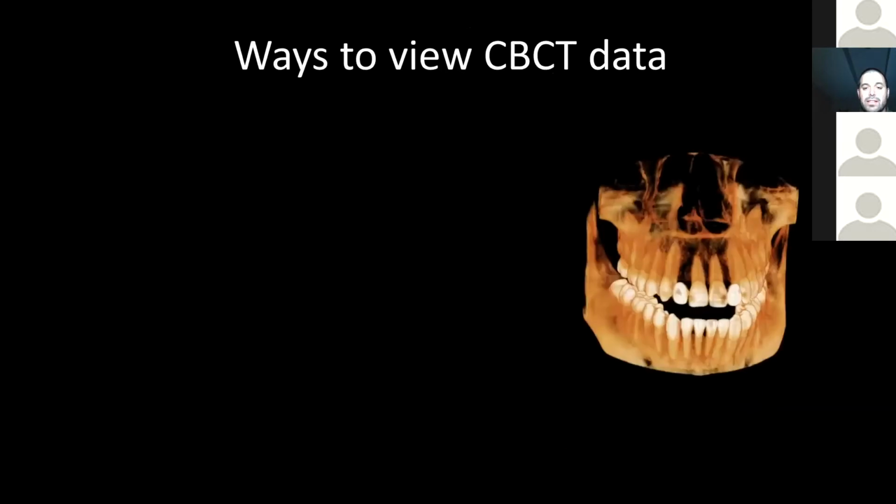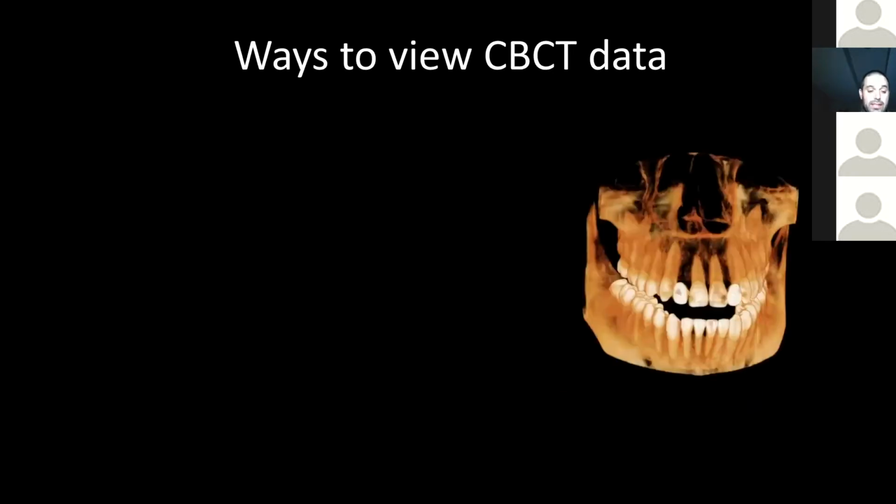Okay, so that's slices. Bottom line, it's the most accurate and the most detailed view of the information. And if you're going to be reviewing that information and getting all the information you can from it, you have to be looking at the slices. The downside of it is it's easy to get lost. So you need to look at your crosshairs, practice that mental gymnastics, know your anatomy, and dynamically work through those slices to know what you're talking about.